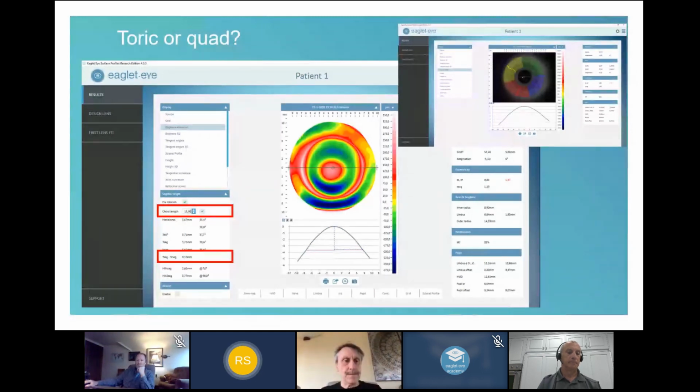I think that at the moment that you're designing a simple spheric optical zone, so that means no front cylinder, no multifocals, no wavefront aberration control, a certain amount of decentration is acceptable. And at that moment, you can still consider going for a toric lens.